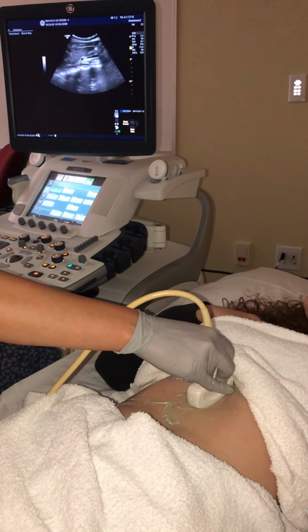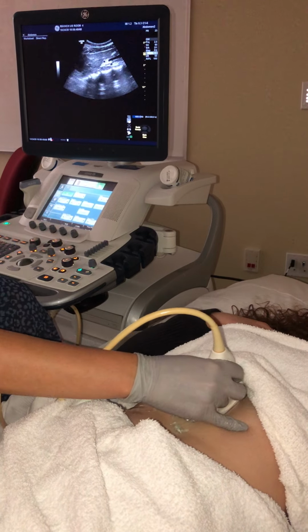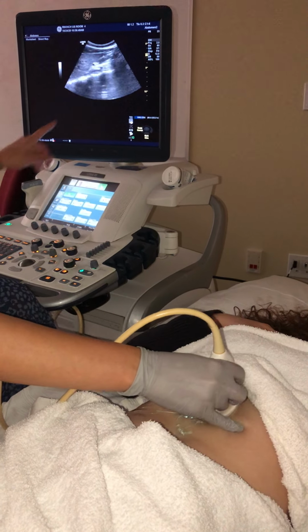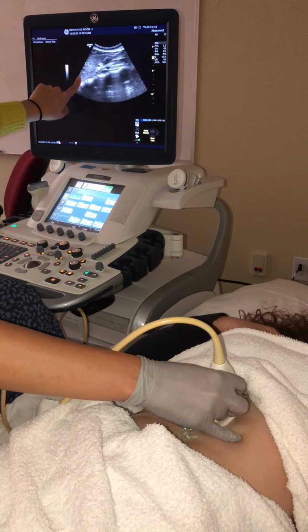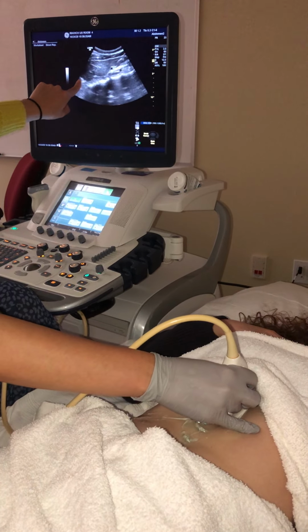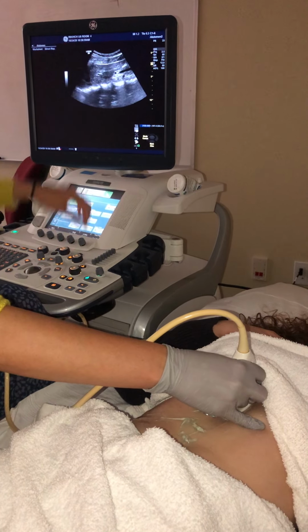So we start right here, sagittal transducer position. It's going to give us our sagittal left lobe. I'm moving up pretty high on her. As you can see, we're cutting off a little bit of this left lobe tissue, so we want to scoop up, and we're going to get that to come into focus here. So we're seeing more of that tissue there.